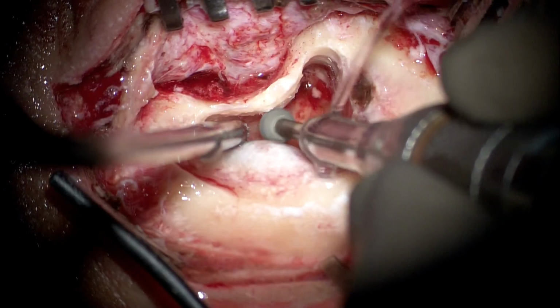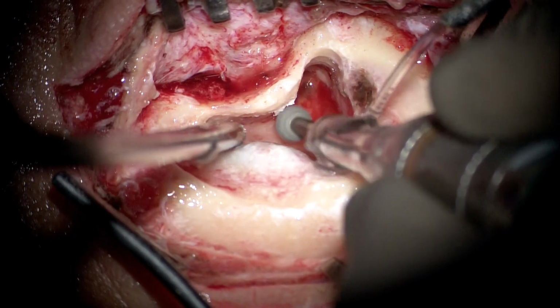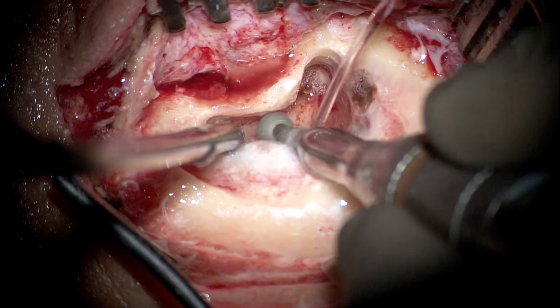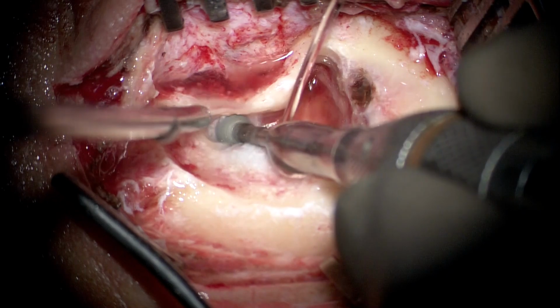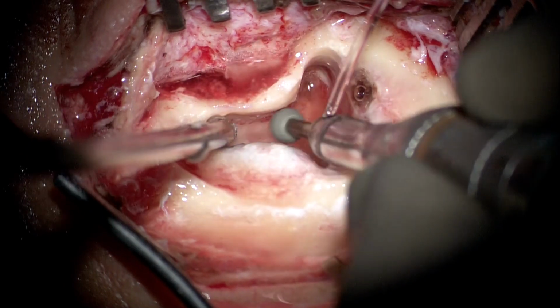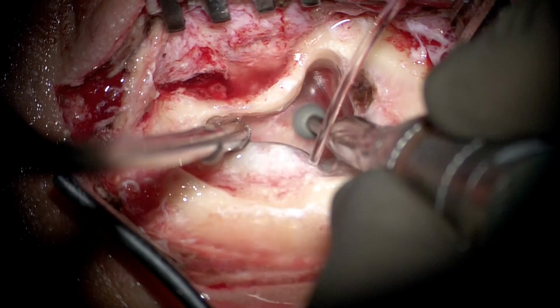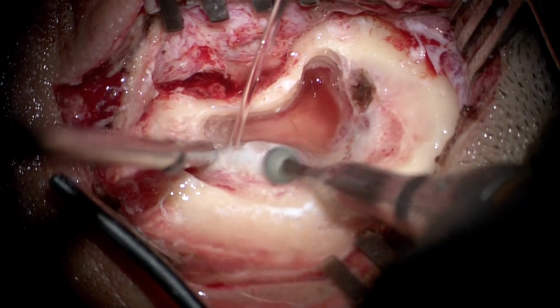Now one can certainly appreciate the amount of restriction we have in the overall picture, though one can start seeing better because of the fact that we have drilled in front of the sigmoid sinus. But one has to understand that this is with regards to very superficial drilling, and if one was to clear cholesteatoma or some other disease or do a basic cortical mastoidectomy, this would have been sufficient.